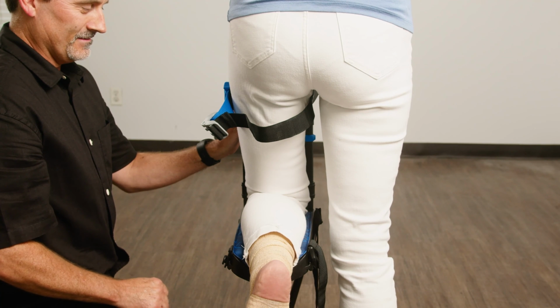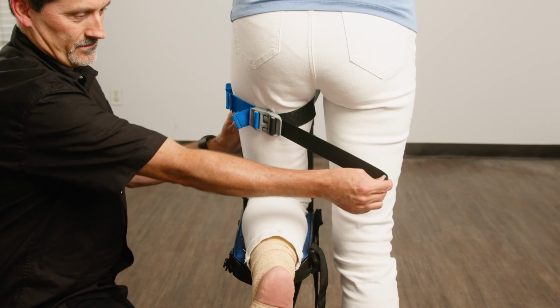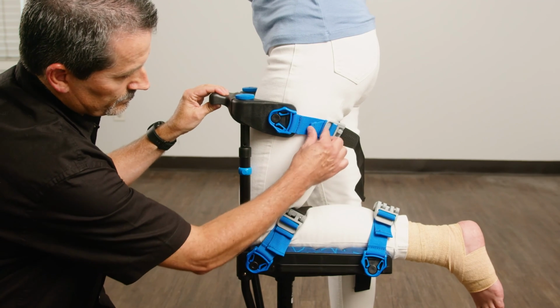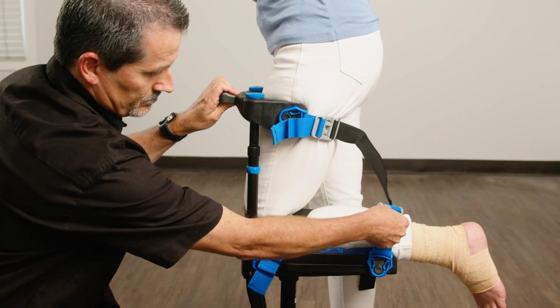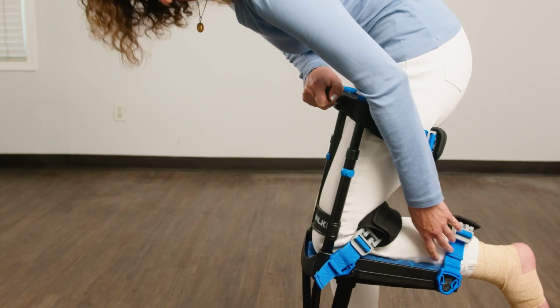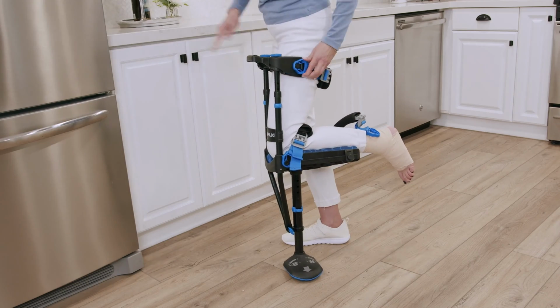The black section is typically a one-time adjustment used when first fitting the patient. The black section's only purpose is to adjust the length of the strap to fit the patient's leg. The blue section is used only when donning and doffing the crutch. You use it to fully tension the strap when putting the crutch on, and releasing the tension when taking the crutch off. The patient will tighten the blue section every time they put on the iWALK, and they will loosen the blue section whenever they take off the iWALK.